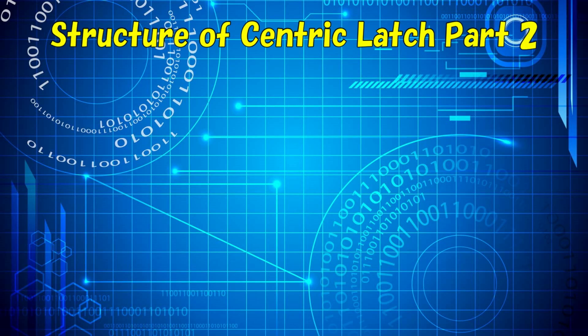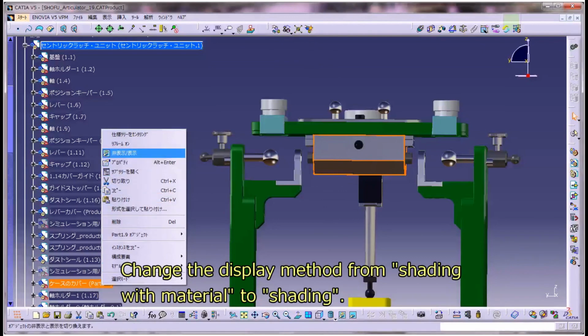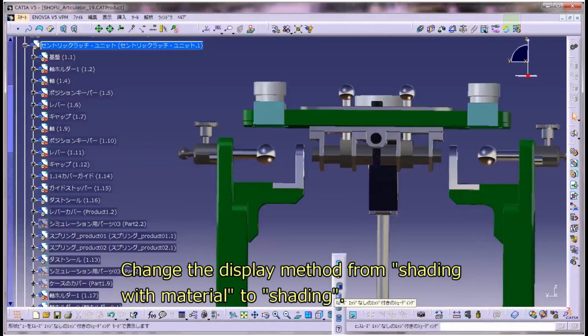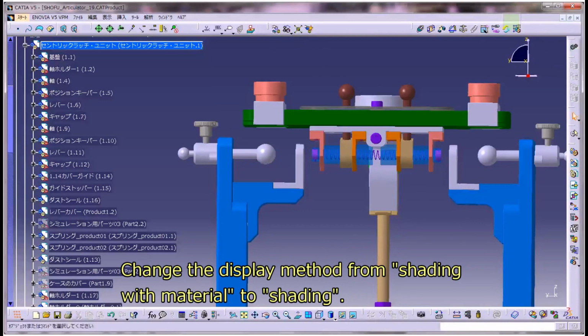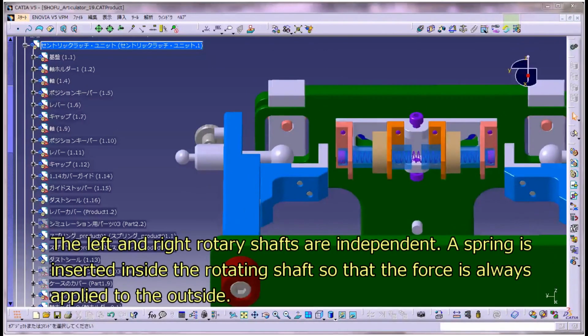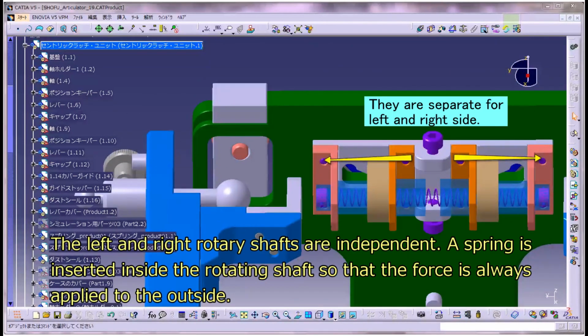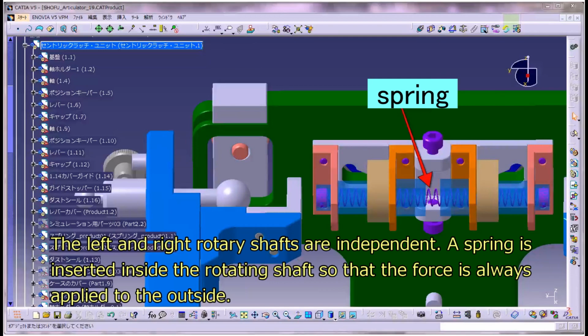Structure of centric latch Part 2. Hide the cover at the bottom of the centric latch. Change the display method from shading with material to shading. You can see the inside of the centric latch. The left and right rotary shafts are independent. A spring is inserted inside the rotating shaft so that the force is always applied to the outside.